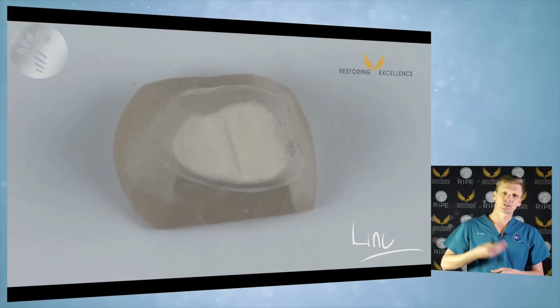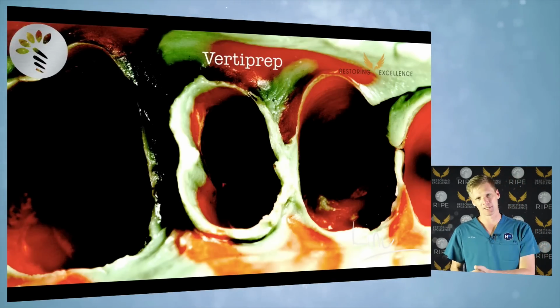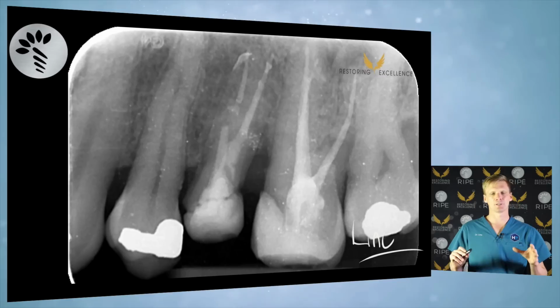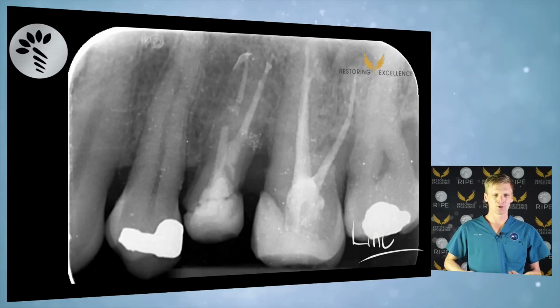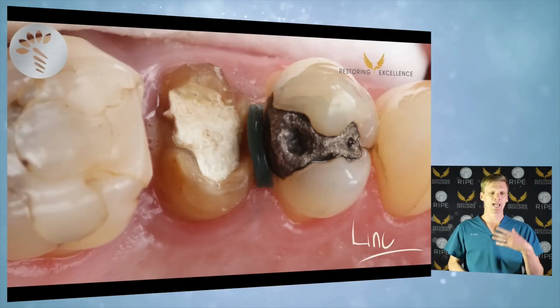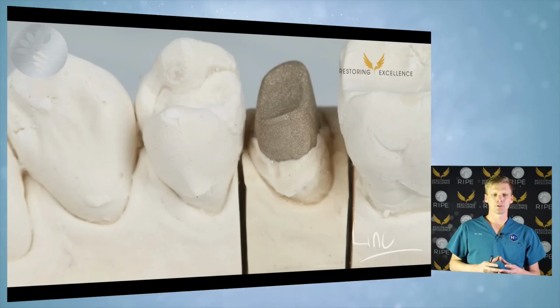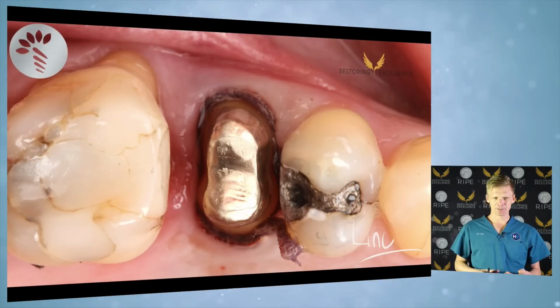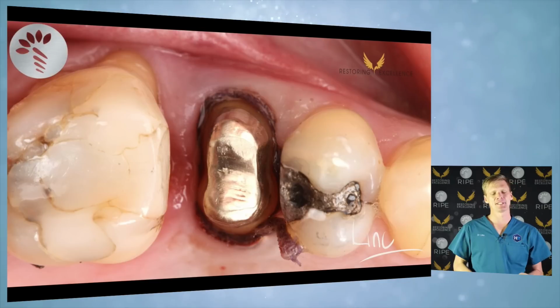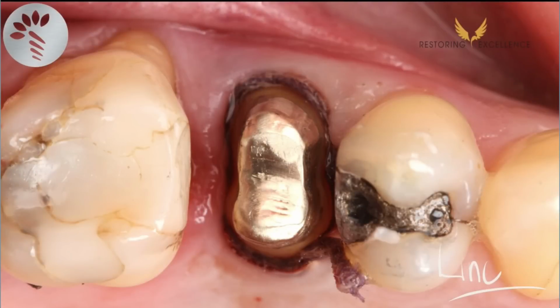So it's just a routine, okay? What's hard about it? It's hard up here because we want to skip the steps. It's mentally difficult. It's not difficult from a concept point of view. This is a very deep margin again on the distal, and the tissue was inflamed. We were doing a gold post and core. On the distal there, it's about 1.5 millimeter subgingival, and it was bleeding like crazy. This one, I probably should have put a temporary crown on and come back because it would have been quicker.